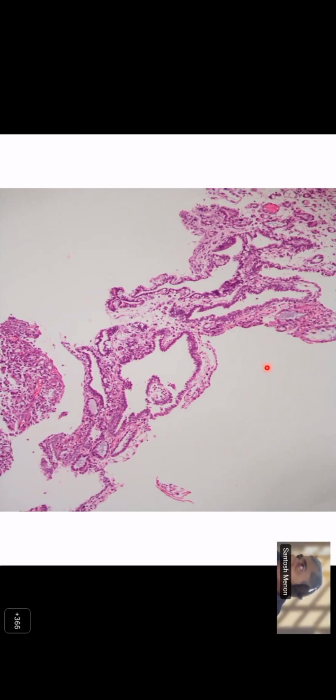What else do you see in this case before you label it benign or malignant? In general, in cancer pathology, before you jump and call something malignant, what will we look for? Any cytological atypia, mitosis, necrosis. So please don't forget those basic things. In pathology, mitosis, necrosis, cellular atypia is very important. Cellularity, these are the things which you look for in any pathology to label it as malignant.